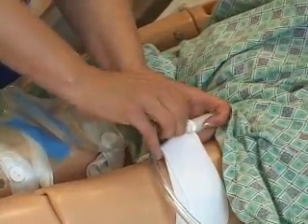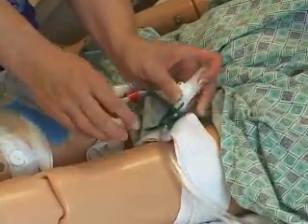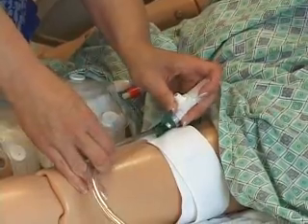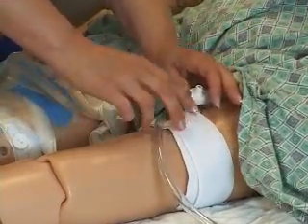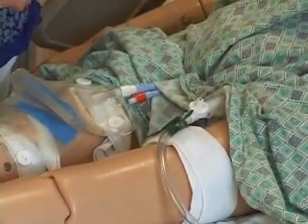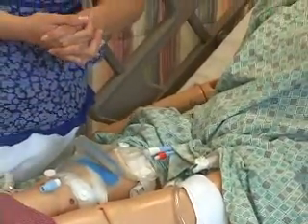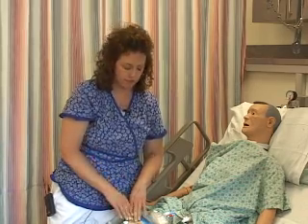At this point, you can disconnect the bag from the leg strap and disconnect the leg strap from your leg, and put this in a bag for storage. To cleanse the bags, you can use either a syringe or a poultry baster that you've bought specifically for this purpose with soapy water to rinse through the drainage tubes into the bags. Also, at least once a week, you should use a 1-part vinegar to 3-part water solution, and that will help kill any bacteria buildup in the bags.